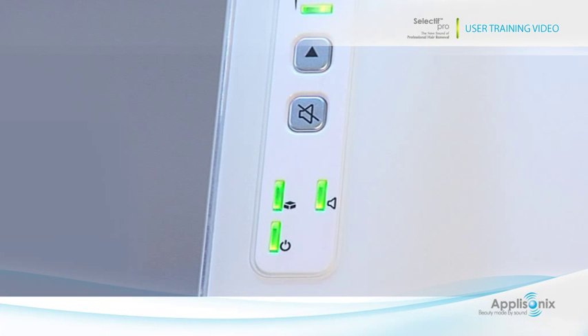Towards the bottom of the panel, there are two status lights that provide an indication regarding the status of the system. At the very bottom is the power indicator. A green light indicates that the system is on.